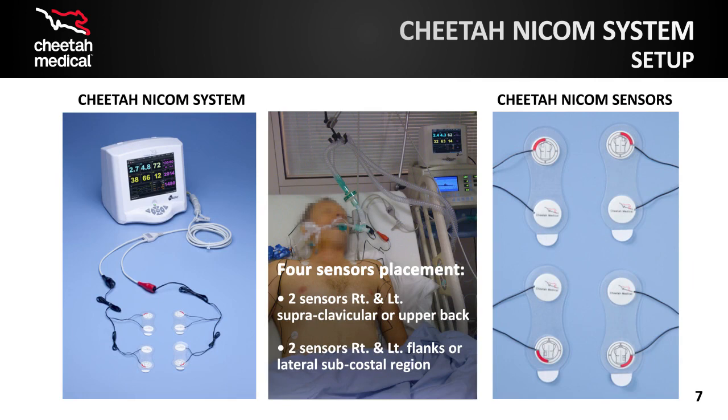The picture on the left shows the Cheetah NICOM system fully assembled, with the patient cable connecting the sensors to the monitor. The picture in the corner shows the placement of the sensors on a patient, which is described further in the lower right box.